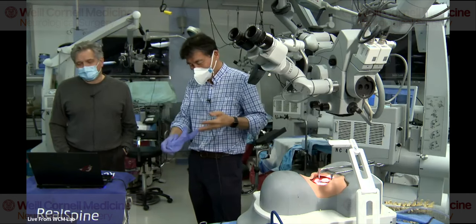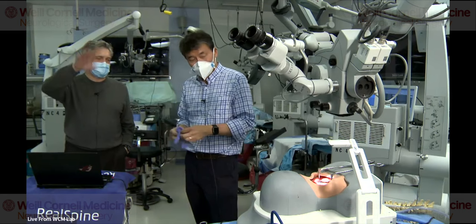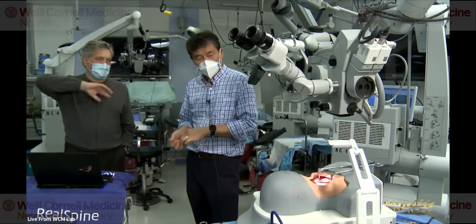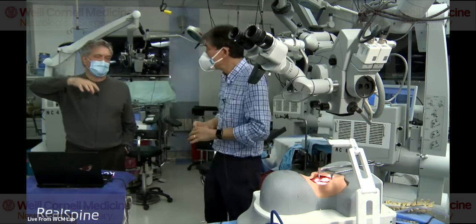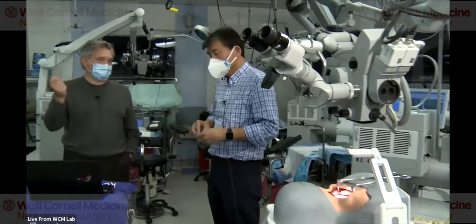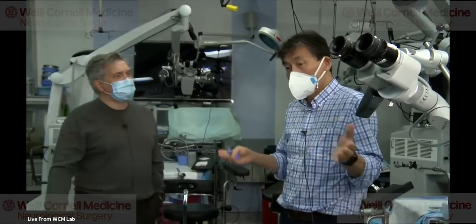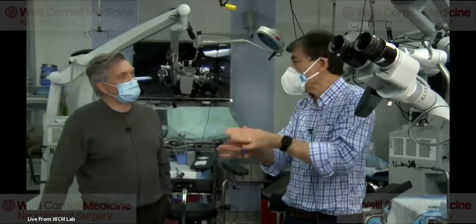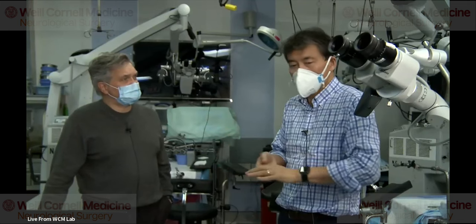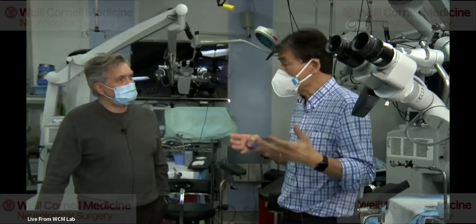What about at the end when you do the closure? You said the muscle is going to attach to that elevated bone. Is there anything that you do to facilitate that? Do you attach the muscle specifically to the bone? No, I don't. When you go back on these patients, you see that it's all scarred down there. And if you've done a good job of dissecting the muscles, then the muscles look really good.